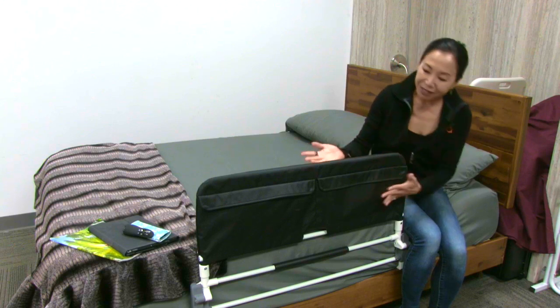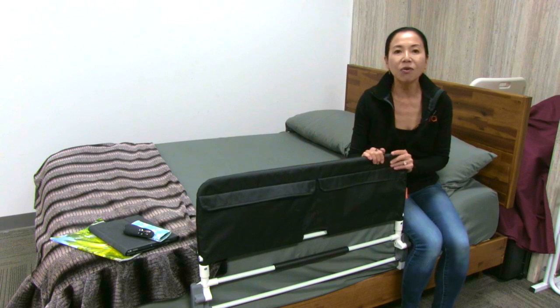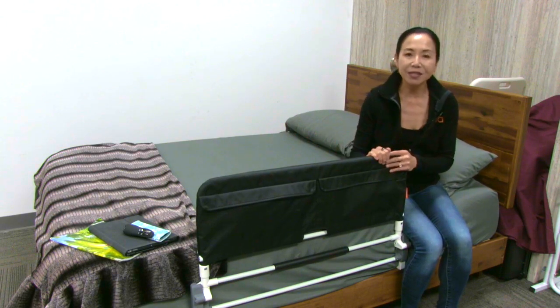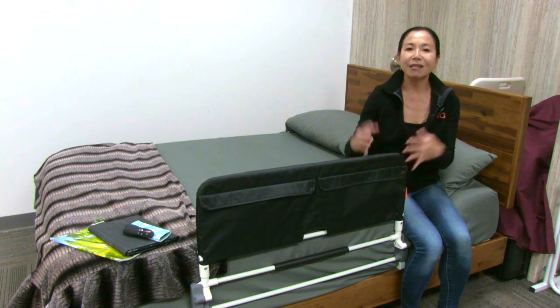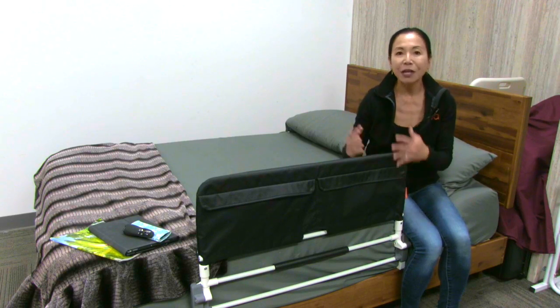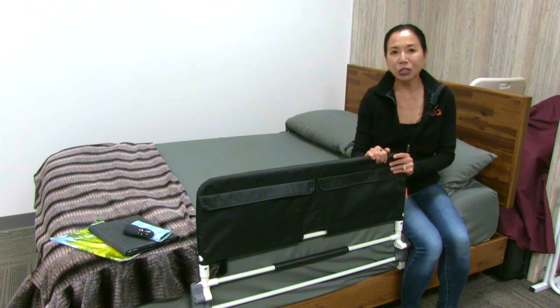But oftentimes the stigma of putting a bed rail on an adult bed just seems so unnatural, and it seems to really impact someone's independence. But I want you to think about this bed rail in a different way — think about this as an independence product, as a product to protect people that you love, a product to protect yourself, to give you more security.